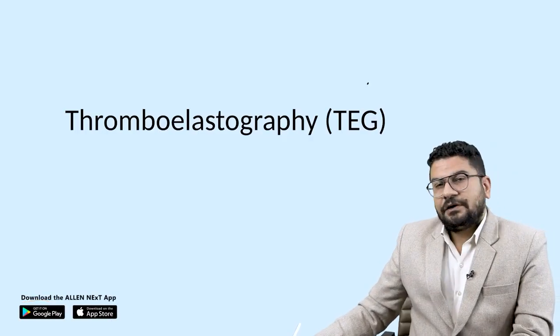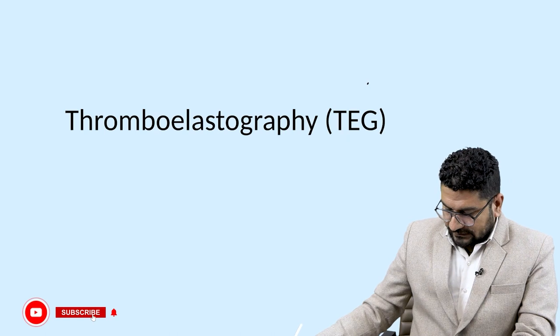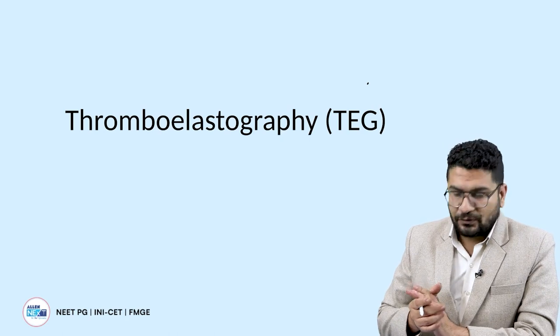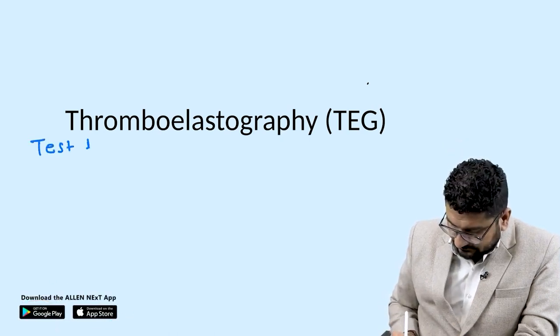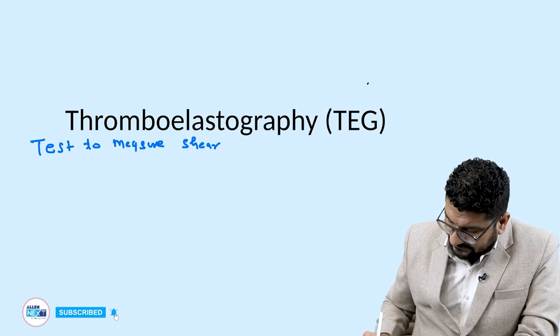Okay, guys, so in this video, we'll talk about a complicated topic which is frequently tested in INI-CET exam, that is thromboelastography. So just try to understand this. What is a thromboelastography? It is a test to measure shear elasticity.